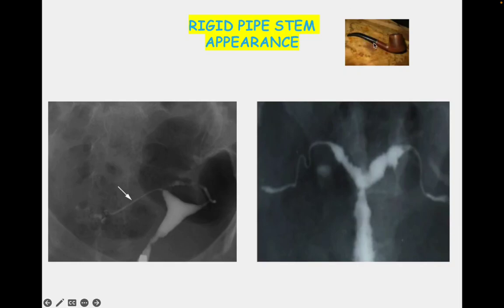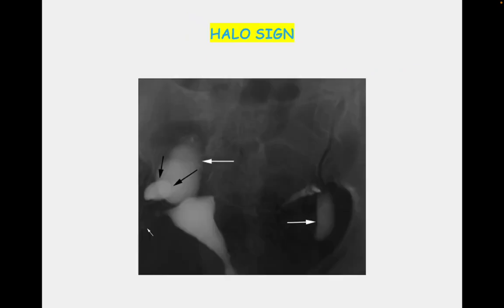Rigid pipe stem appearance is also seen in tuberculosis patients. The tubes appear like a pipe stem because peritubal adhesions restrict the normal motility of the tubes, giving the appearance of a rigid pipe stem.